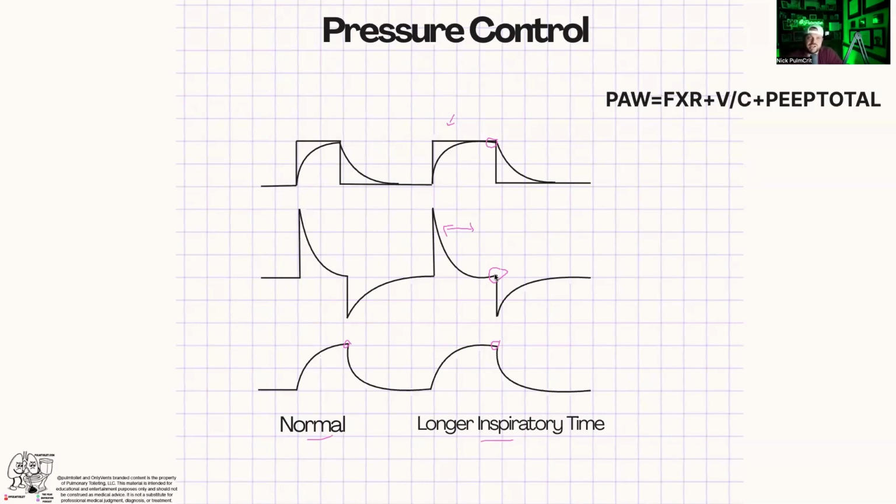It's helpful sometimes in ARDS if you want to monitor the plateau pressure in real time instead of doing it yourself. But you would see there's no flow from here to here. So you're just at your plateau pressure. You're just at your alveolar pressure.